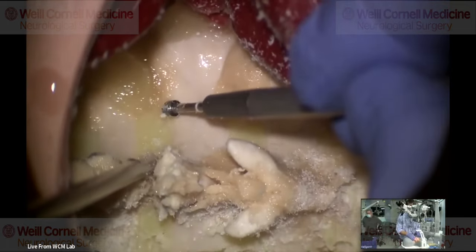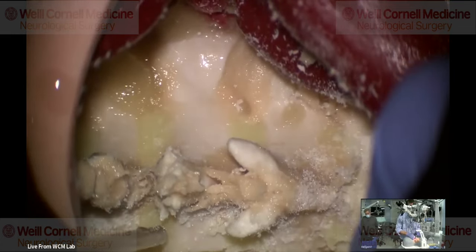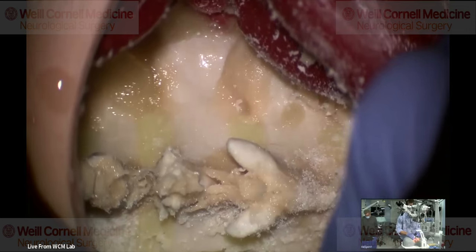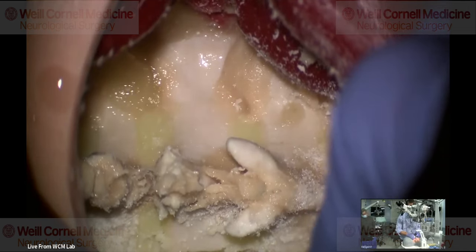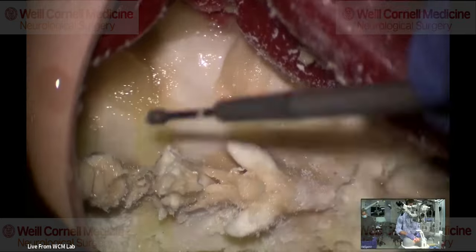All right, so on the hinge side, it's slightly different. On this one, I just started here and brought it this way. The other thing is you want to pull on the burr, you don't want to push. When you push, you can all of a sudden snag and then go. Whereas when you pull, it's like the difference between a front wheel drive and a rear wheel drive car. It's better to pull the car than push the car.